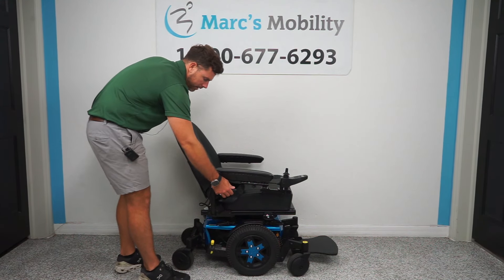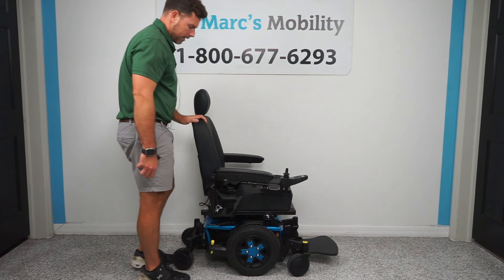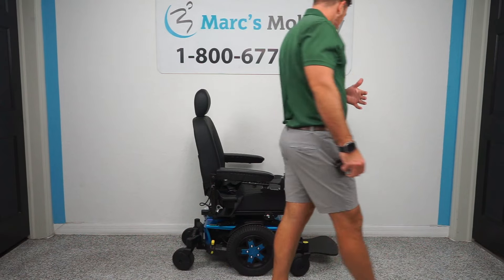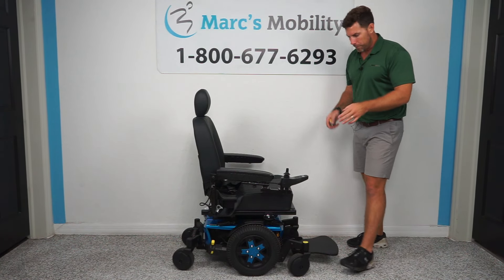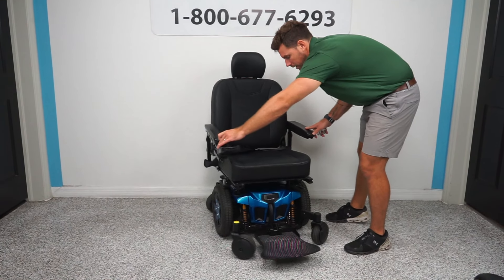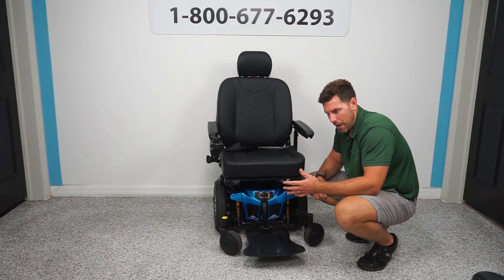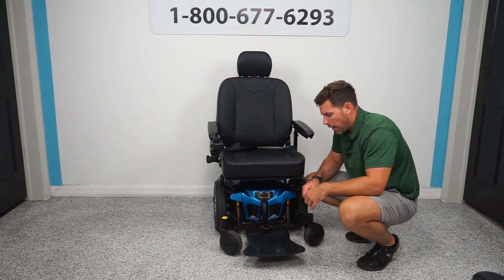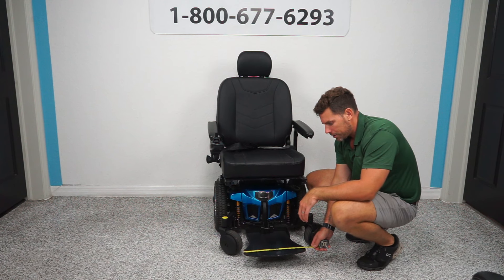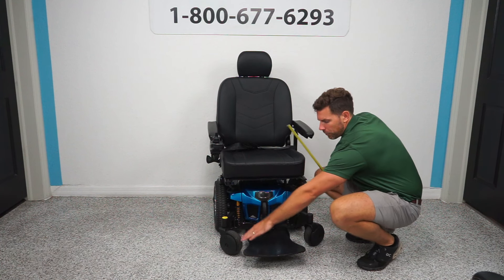The backrest looks like it has about a 110-degree limited recline. It can fall all the way down flush if you need to load this into something, but the typical driving position is going to be just a little past 90 degrees for a comfortable ride. The footplate on this particular unit is what they call their XL bell-shaped footplate — it is a very large footplate. It is about 13 inches in depth, and the width at the widest point is 14 inches. It's a little more narrow between the wheels at 10 inches, since the caster wheels swivel around.